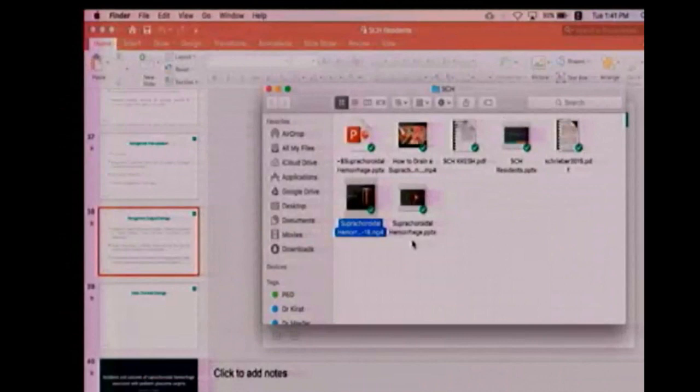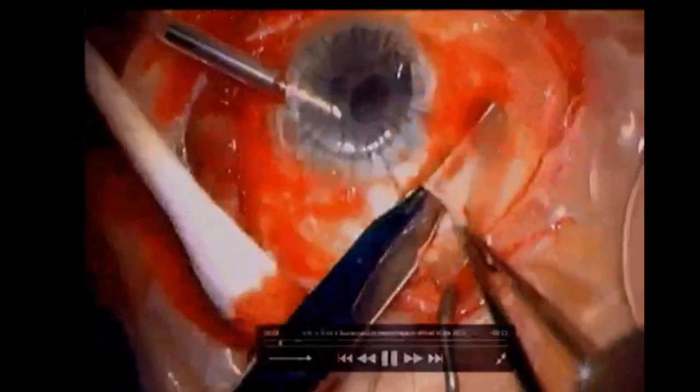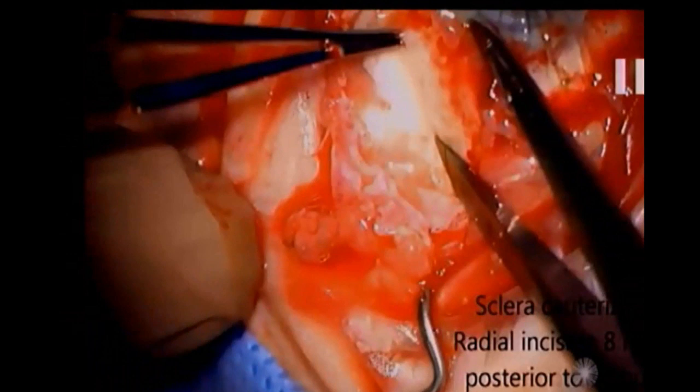So this is a video that won the Young Ophthalmologist Award 2 years ago in the Academy. It's a nice video showing. This is a lady that underwent PKP, I think, with cataract surgery, so a triple procedure, and then she had choroidal hemorrhage that did not resolve, and after 7 to 10 days, they evacuated the blood.